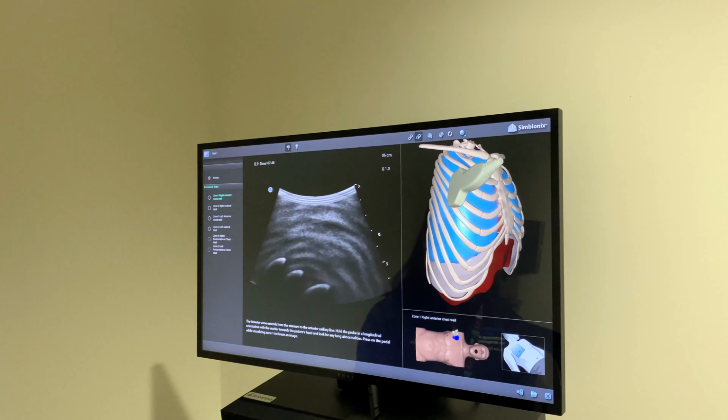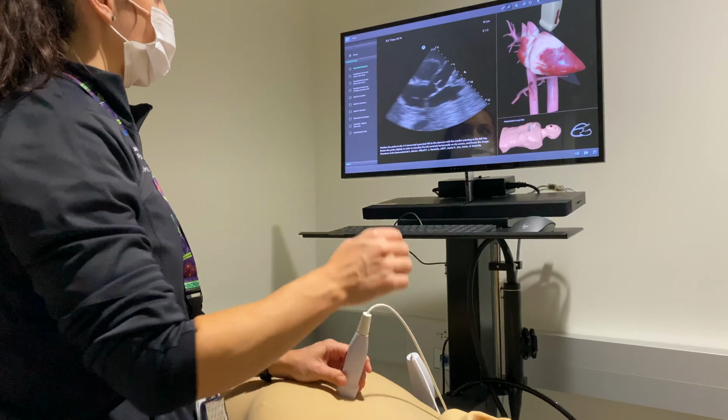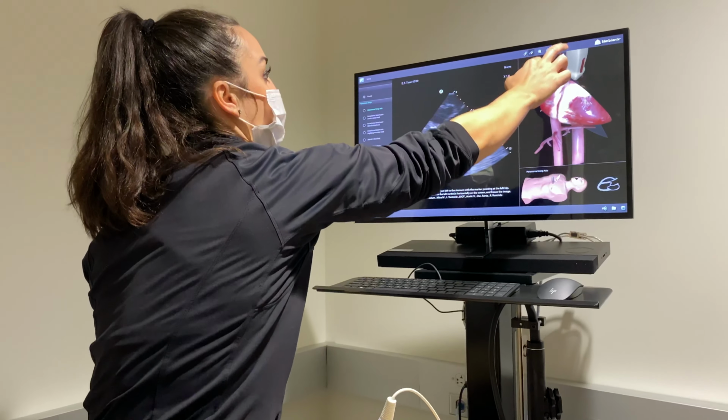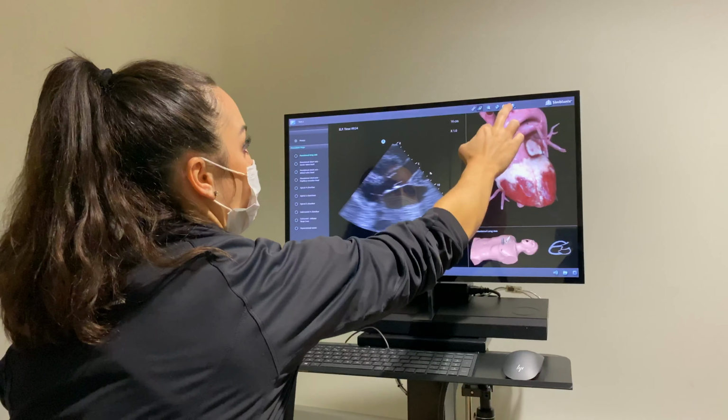Also on the day of the OSCEs, we host a point-of-care ultrasound, or POCUS, workshop for the CA3 class. We have 2 to 3 critical care attendings that are available with standardized patients and ultrasound machines to guide the residents through obtaining transthoracic echocardiography images on actual patients.